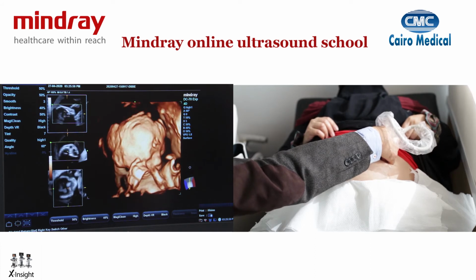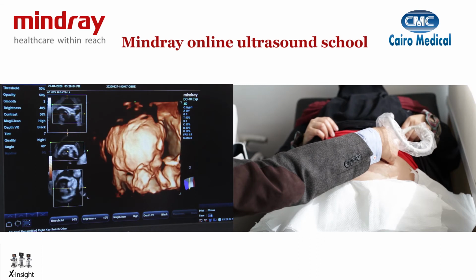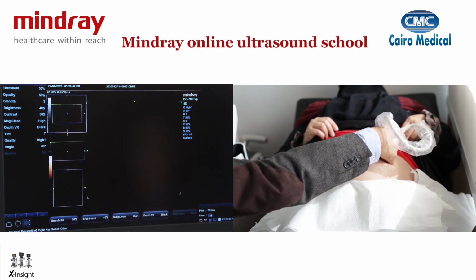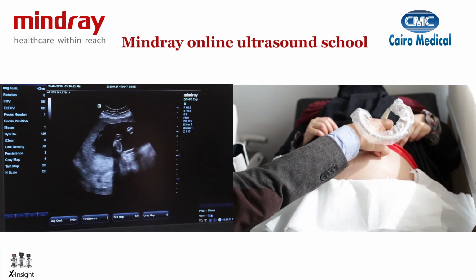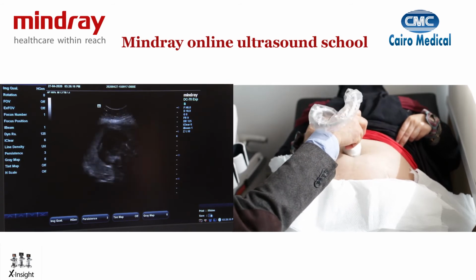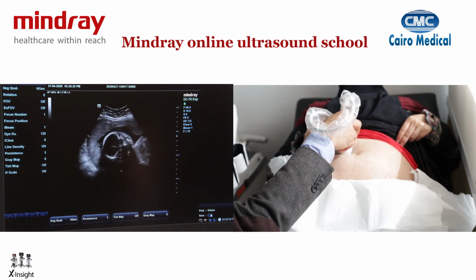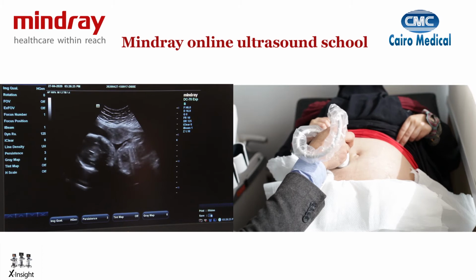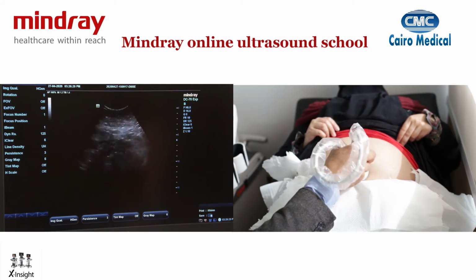You can see the baby's hands in front, or I can flip it around so it faces me, or faces to the side. And I can see the ears here. Okay, so this is the easiest way of getting an image of 4D, which is the surface rendering. Let's do some surface rendering on any target we want. As we mentioned, in surface rendering we'll only be getting surface information, quite quick to achieve and quite easy to do. So, the second easiest way of getting surface rendering is actually looking at the baby's gender.